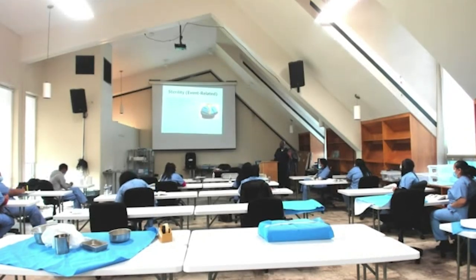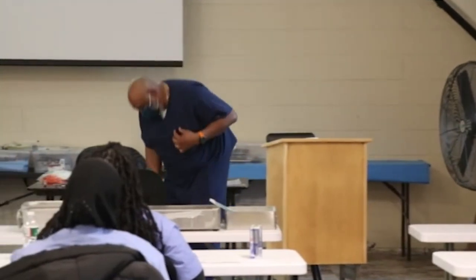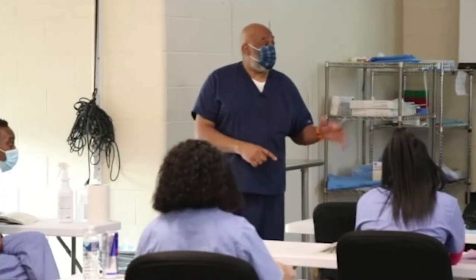So what I mean, and you'll learn it, if it was a one of a kind and it had been damaged, just like instruments in the OR, okay? Sterile field, hand me this, and it drops on the floor in the OR, right? They need it. It's crucial to the case. They send it back to us. It comes to decontam. I tell Shanique, prepare this for IUSS, immediate steam. She still cleans it. When it comes to you guys, the difference between IUSS, immediate use, we won't package it. We won't wrap it. It will go in a special container that we use for our IUSS sterilizer.